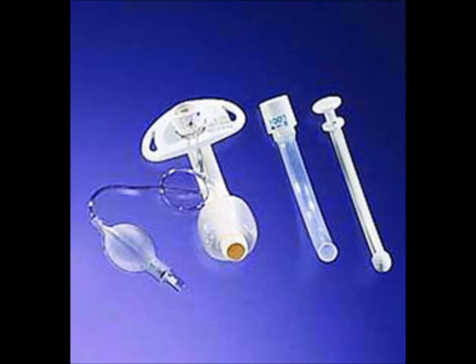The basic parts of this tracheostomy tube are the cuff that is inflated during mechanical ventilation, which is also there to prevent aspiration. The cuff is inflated with air to maintain a seal around the tube. This allows airway exchange to only occur through this tube, meaning no air exchange between the nose and the mouth. Use of this Shiley does not allow the patient to talk.